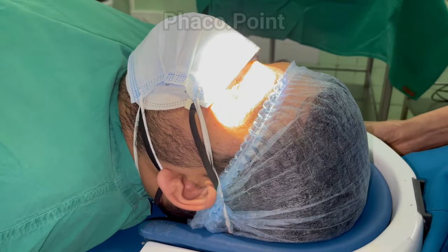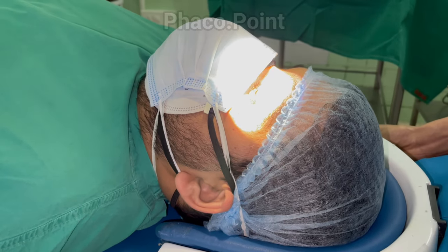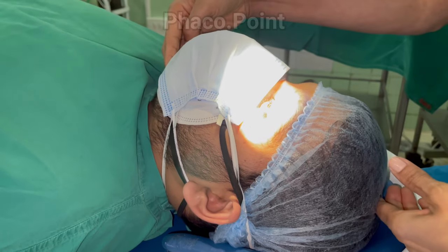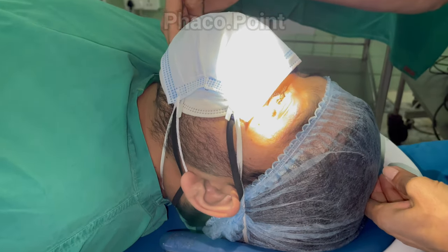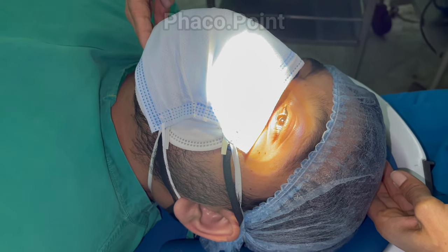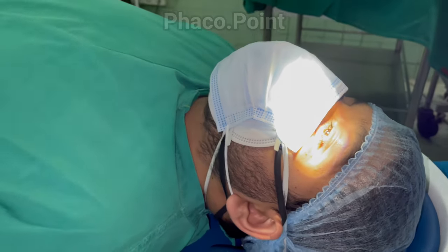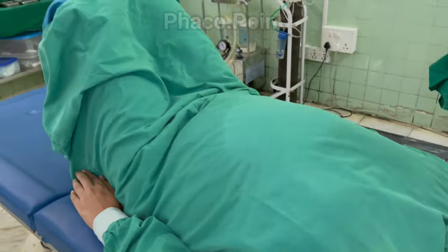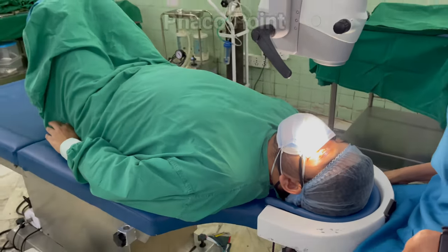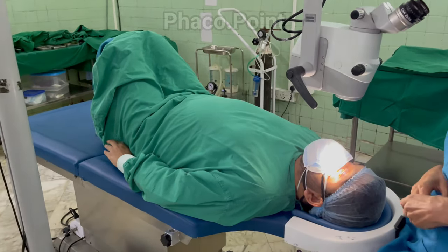It's important that the patient also be equally comfortable during the surgical procedure. I like to tilt the chin up slightly so that the iris is parallel to the floor. Sometimes a simple thing like asking the patient to lift their knees can make them much more comfortable by reducing lumbar lordosis, which is especially beneficial in a slightly longer surgery.